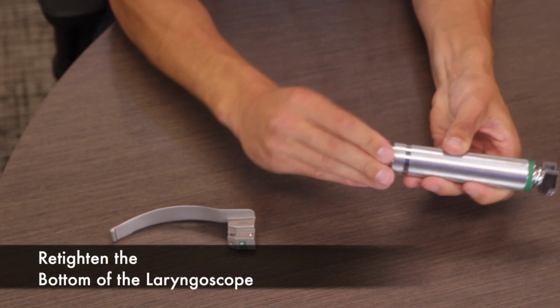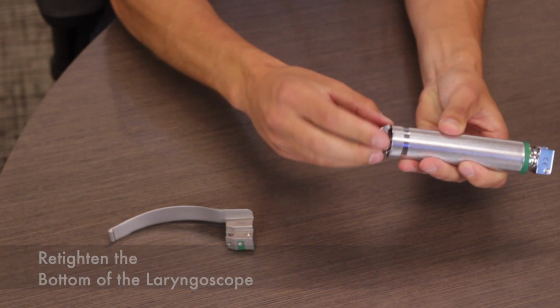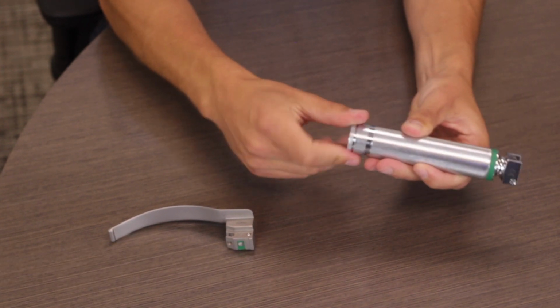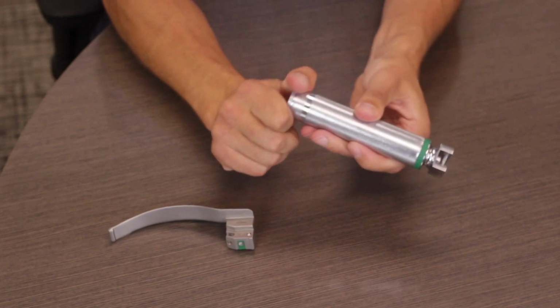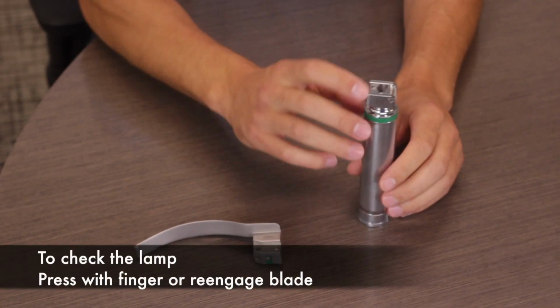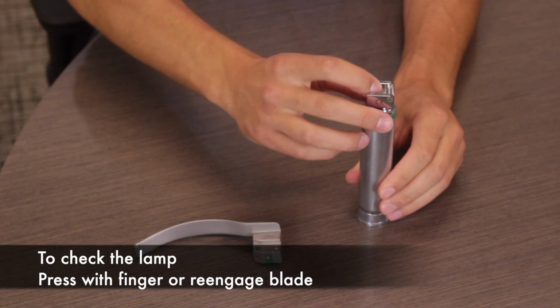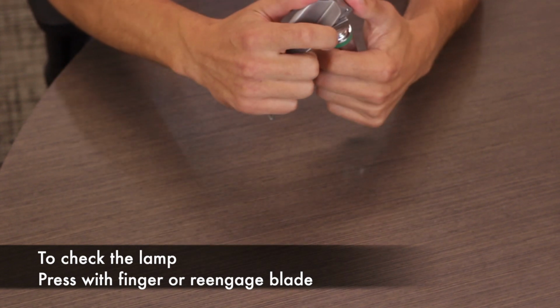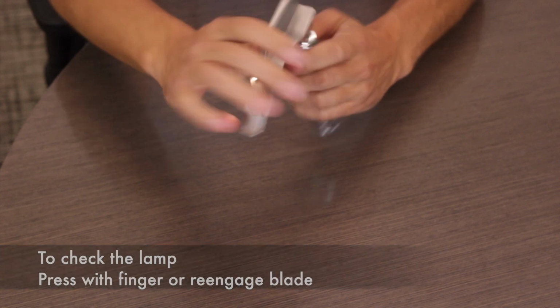Lastly, you retighten the bottom of the laryngoscope, and it's ready for your next intubation. We always recommend double checking that the lamp is functioning properly. You can check with your finger, or you can check by re-engaging a blade.